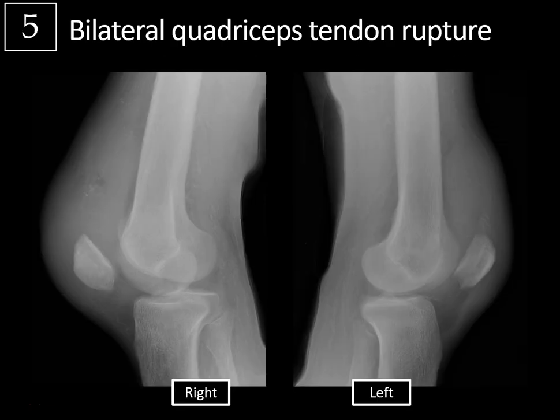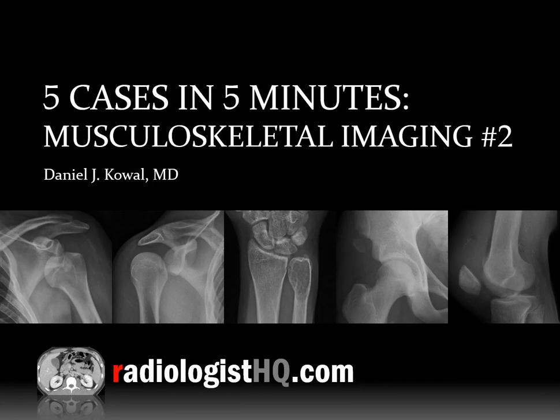Case 4 — anterior superior iliac spine avulsion fracture and lesser trochanteric avulsion fracture. Remember this in your search pattern for pediatric athletes. Most commonly, avulsion fractures occur at the ischial tuberosity related to the hamstring. The ASIS is where the sartorius and tensor fascia latae attach; the lesser trochanter is where the iliopsoas attaches. Case 5 — bilateral quadriceps tendon rupture: look for patella baja. Quadriceps tendon rupture occurs more commonly in patients with underlying abnormality like connective tissue disease, corticosteroid use, and end-stage renal disease. That is it for 5 Cases in 5 Minutes, MSK Imaging No. 2.